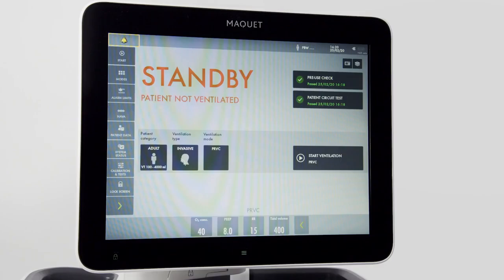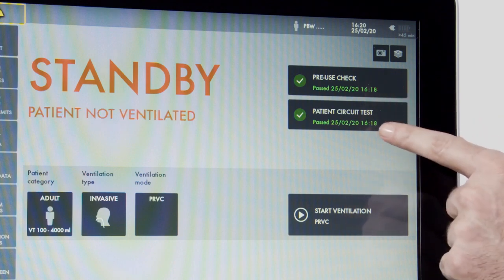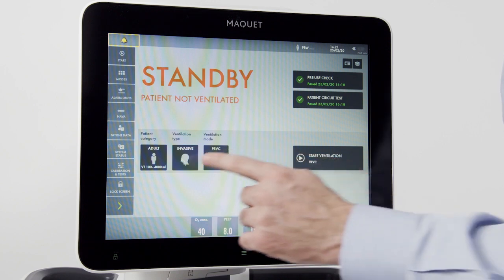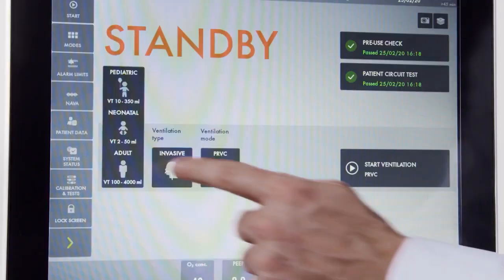Note no ventilation is occurring while we are on standby. In the upper corner, I can see the results of my pre-use check and my patient circuit test. I can also run the circuit test separately. Down here I have my patient category, where I can select pediatric, adult, or neonatal.